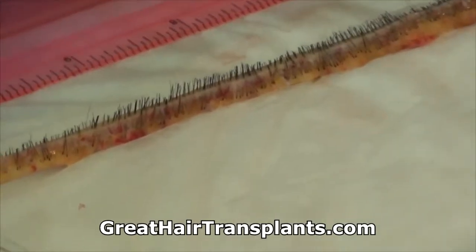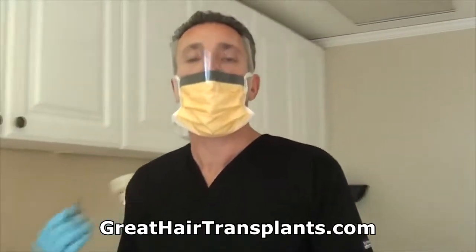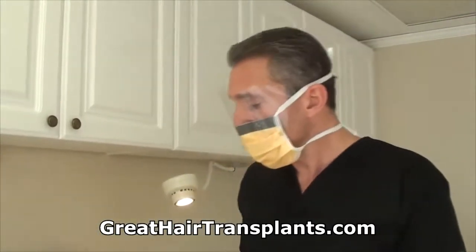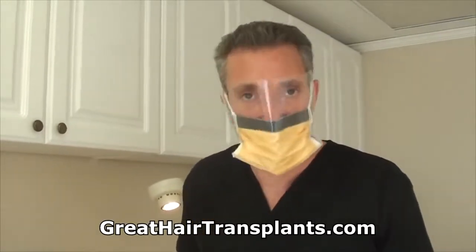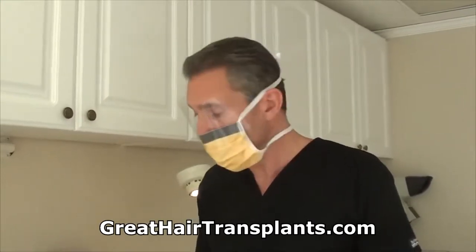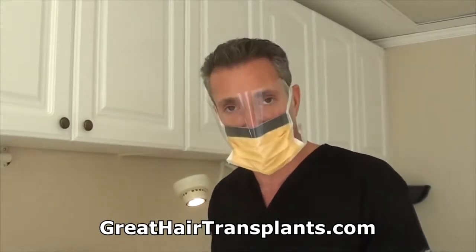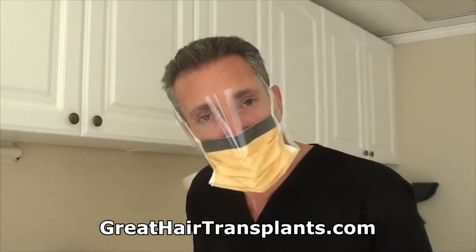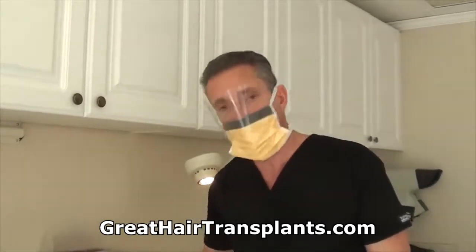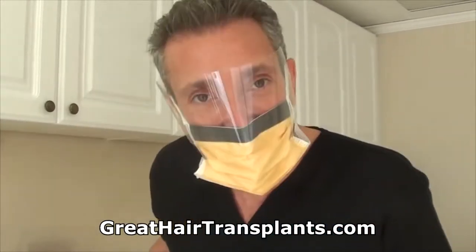So then we're going to show you how that comes out when we cut the grafts. This is what a follicular extraction looks like. Now we're going to show you what it looks like when we dissect that up. Now for those of you who are watching this, if you're a doctor who does follicular extraction, you're going to say, well, my grafts come out a lot better than that. I'm going to have a much better follicular unit than Dr. Bolton did. Well, let's say you do. Let's say you do a lot better than me on your follicular extraction. You're still going to have transection, and you're going to have much more transection than I ever would in a strip harvest procedure. And you, doctor, know that, and I know that.